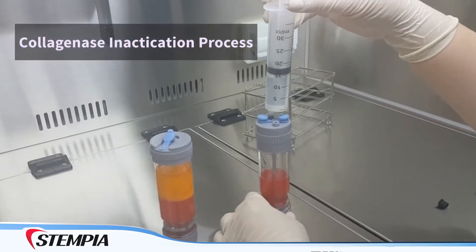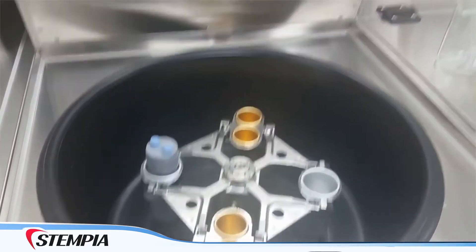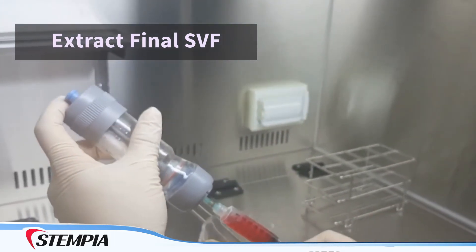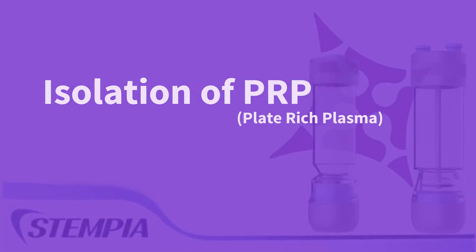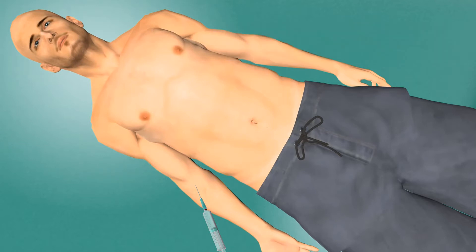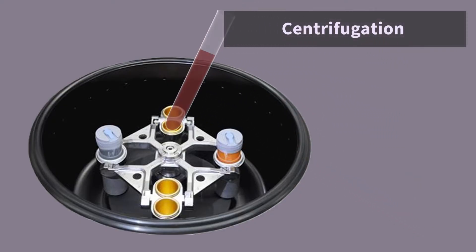Now the stem cells are transferred into Stage 2 to start the collagenase inactivation process. Now 50 cc's of blood is drawn from the patient to obtain white blood cells and platelets, or PRP. Whole blood is centrifuged and the PRP is at the top of the test tube.